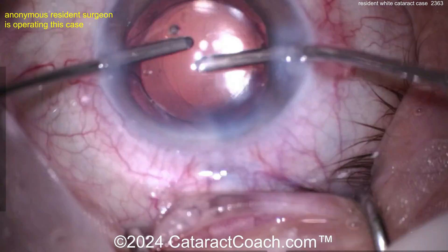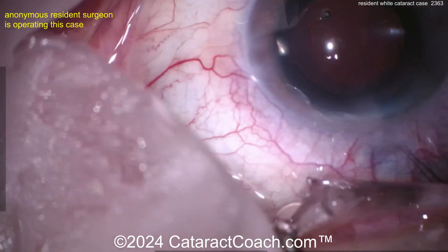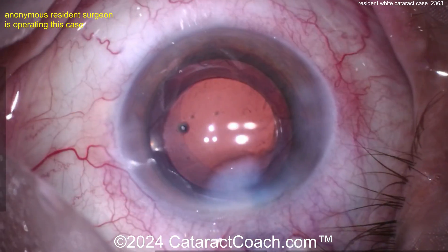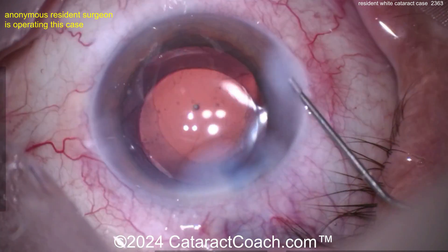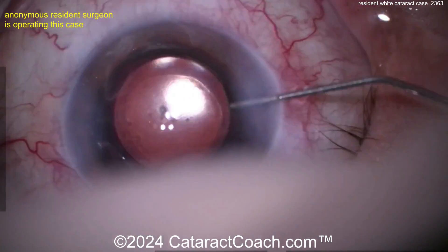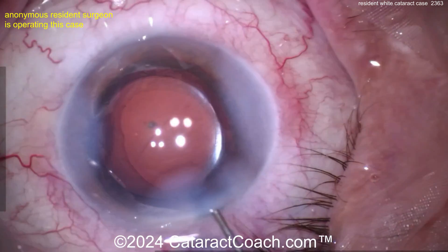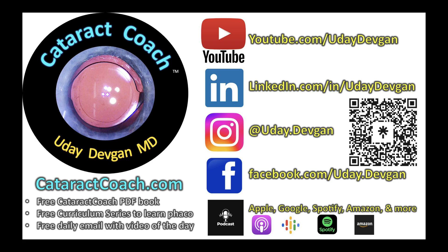Really pretty good overall case — I like it. Fix that draping and make the rexis a little bit nicer and I give you a solid A. Beautifully done, keep up the good work. Remember, if you're a young resident or young doctor learning surgery, go to cataractcoach.com. Download the free PDF book, check out the curriculum series — I do all this just to make you a better surgeon, and all these resources are totally free.